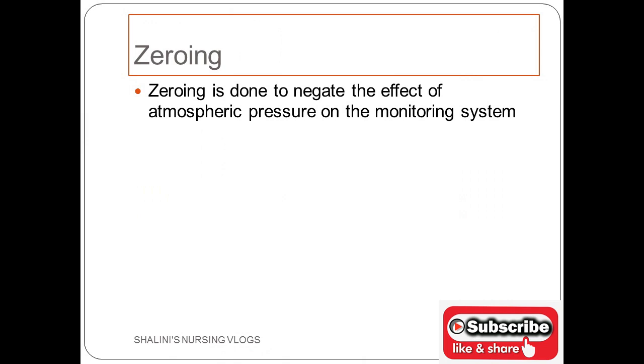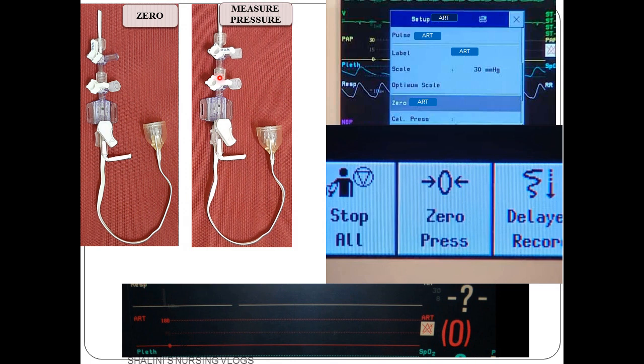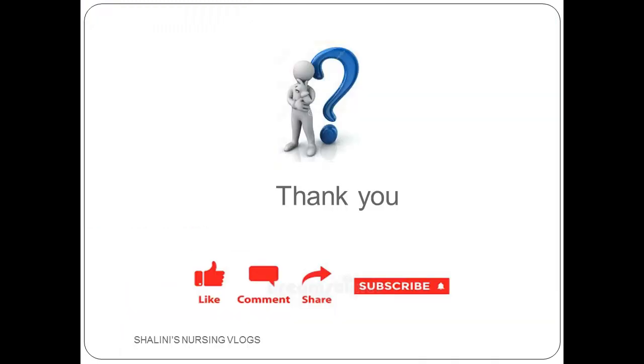Technically, zeroing is done to negate the effect of atmospheric pressure on the monitoring system. For zeroing, close towards the patient, open towards the atmosphere, and open towards the transducer line. Then press zero on the monitor — you will see zero displayed. After that, close the three-way towards the atmosphere, open it towards the patient and transducer line, so that you get an accurate pressure reading. Thank you, I hope today's video was helpful. Please leave any doubts or comments in the comment box. Have a nice day.